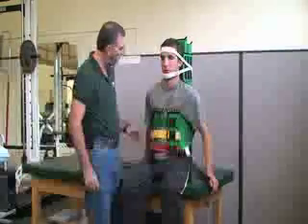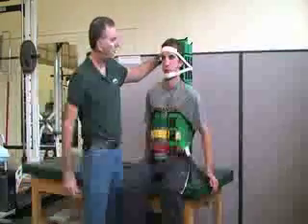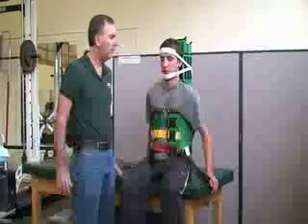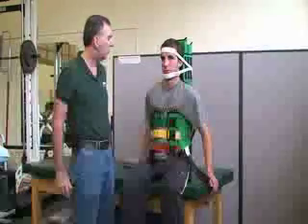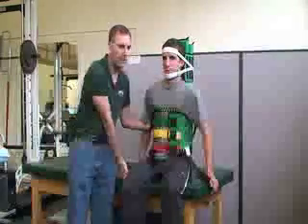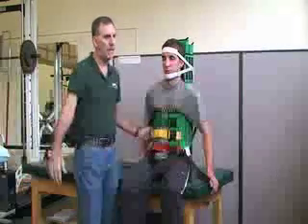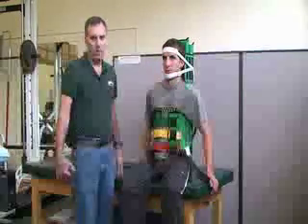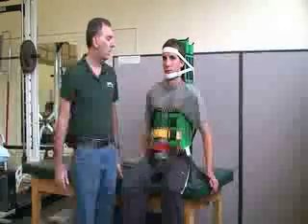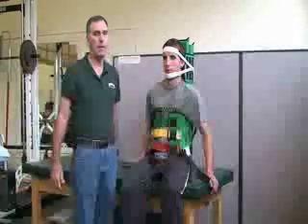Do a final check to make sure everything is secure and the patient isn't moving. You will definitely need someone to help you — if you need to move the person, you have one person on each side to lift them as one piece onto the cart or spine board, so you can get them to the ambulance and to the hospital.